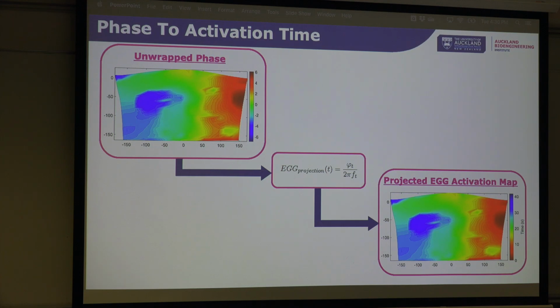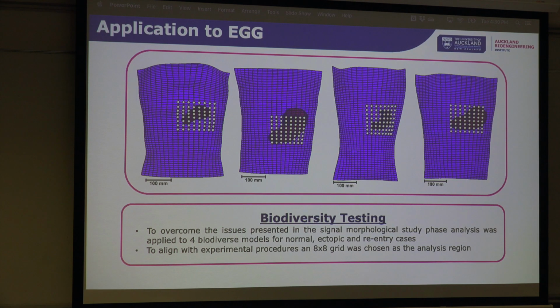So using a combination of all of those techniques, we wanted to apply that to our 4 models that we had previously developed, and see if with these new techniques they actually compensated for biodiversity. Could we get results now that were actually stable across all these 4 subjects?